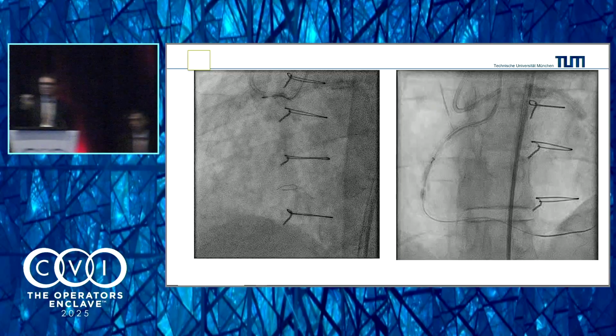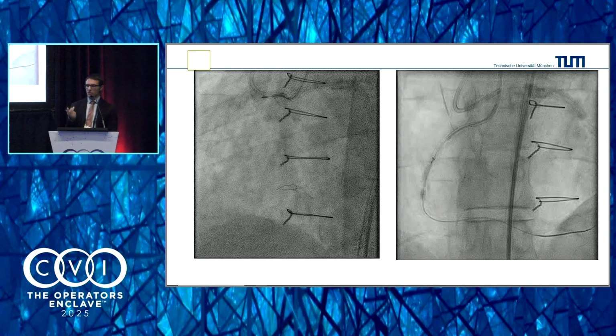No, it's not an angiogram. It's just a check with a little bit, 3 milliliters, of contrast to see if you can see an explosion of the artery or not. Check for perforation. Because all the time I can hear just that, it's the perforation. The perforation is really rare, but just to make beginners a little bit more confident with going to high pressure, please don't go to high pressure from 0 to 20. Try to modulate your high pressure and check every time and keep the pressure there. Don't be afraid. The balloon has incredible resilience.